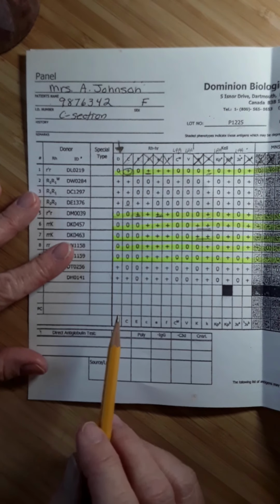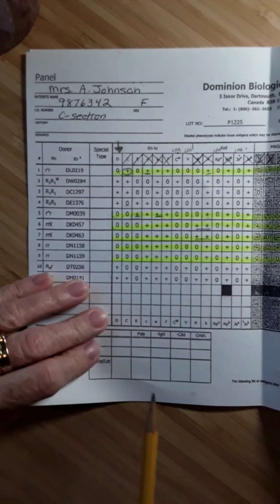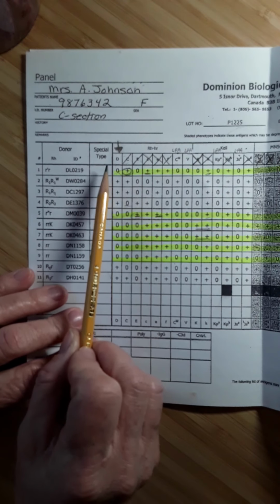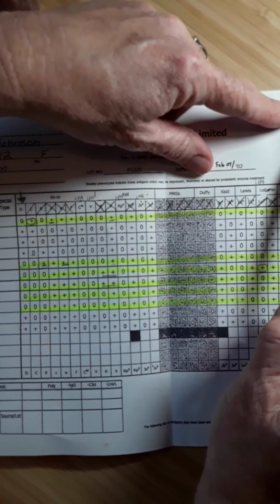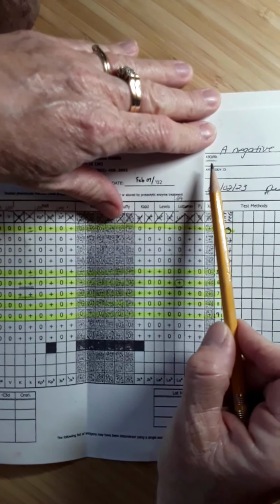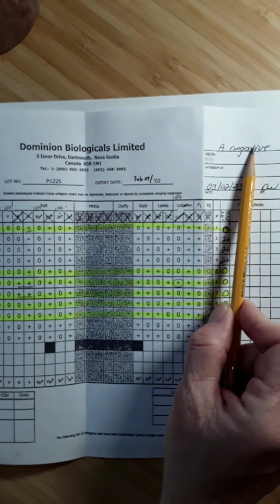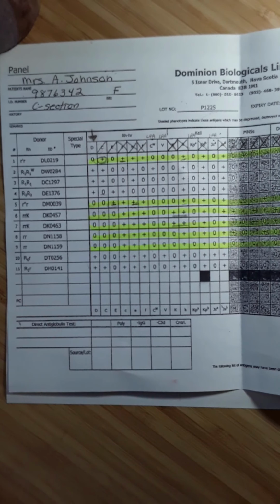Step number 7 on page 10. The next 2 things that we need to do is we need to antigen type the patient. Well, antigen type them for the antigen corresponding to the antibody. So what is the D type on this patient? Well, that's usually pretty easy to find because the patient has been ABO RH typed and the patient is A negative. So the patient is negative for the D antigen and they have produced an anti-D antibody, which is possible.